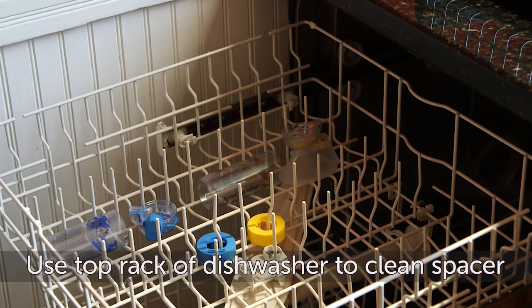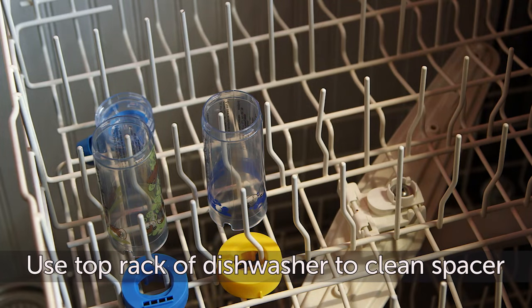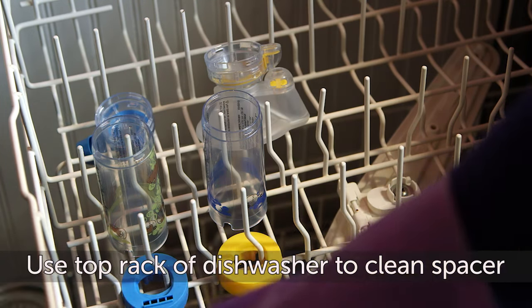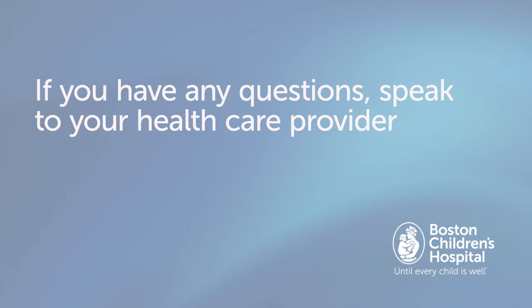If you have a dishwashing machine, you can use it to clean every part of the spacer, including the face mask. Just be sure to put all the parts on the top shelf of the dishwasher. You're all done.